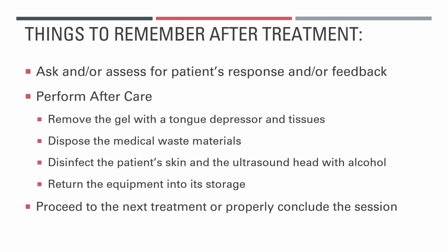So things to remember after treatment: ask or assess for the patient's response and feedback regarding the treatment. Perform aftercare, so remove the gel with a tongue depressor and tissues, dispose of the medical waste materials, and disinfect the patient's skin and the ultrasound head with alcohol as well. Return the equipment into its storage. Then proceed to the next treatment or properly conclude the session. Okay, so that is all. Thank you.